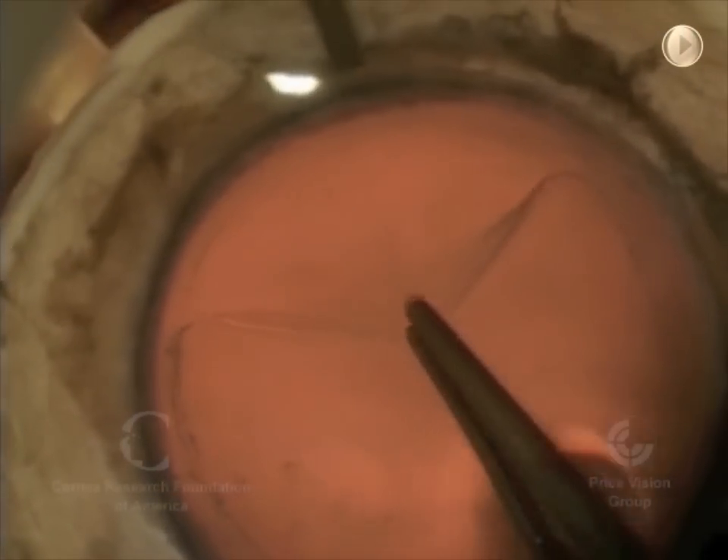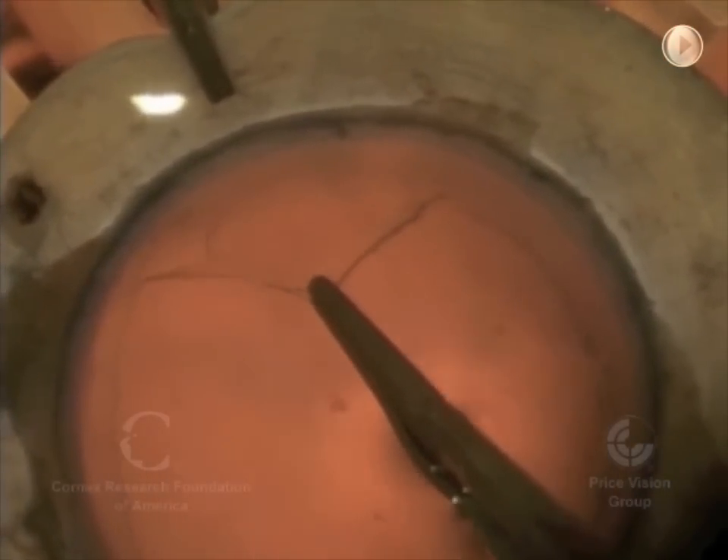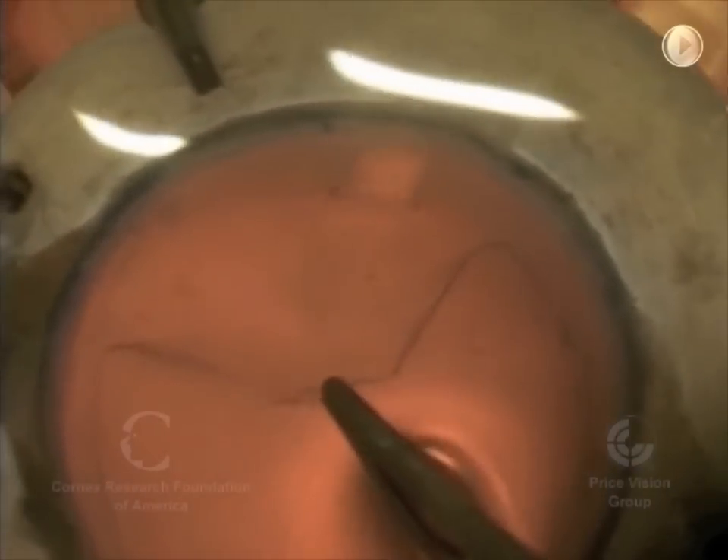Now, once we've gone all the way around, we're going to then separate about one-half to two-thirds of the peripheral amount of Descemet's membrane here, pulling it inward.